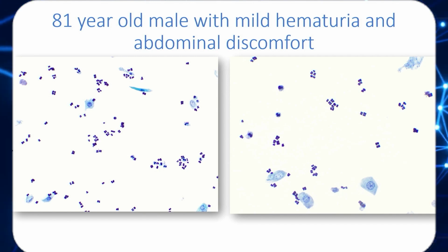And then what's all this here in the background? First glance at low power, you would probably just think nothing of it. Okay, there's some infection there. So this was the highest magnification, so this is basically the highest magnification. So any takers for this? What do you think this is? It is bacteria, and the best answer came from the group. This is Sarcina or Clostridium.